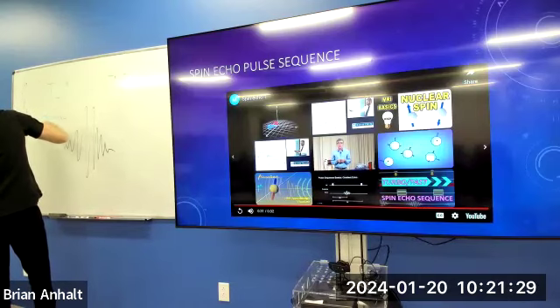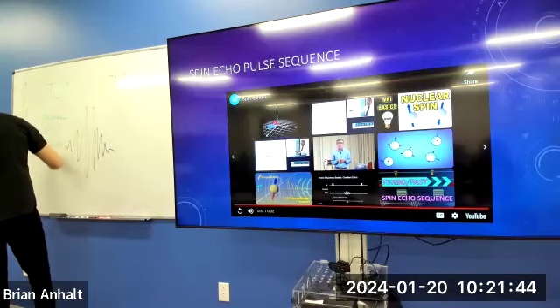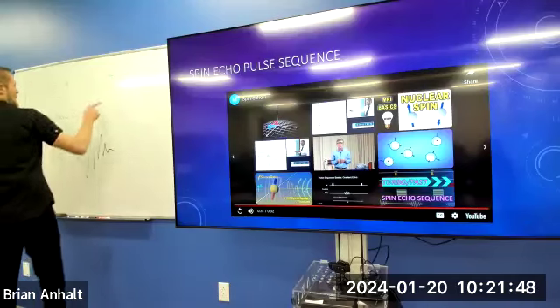Due to what? Right, inhomogeneities and susceptibilities, two words that I don't spell very well.